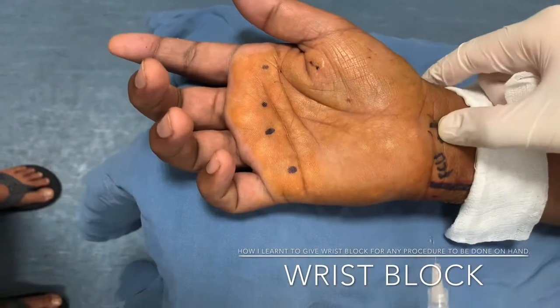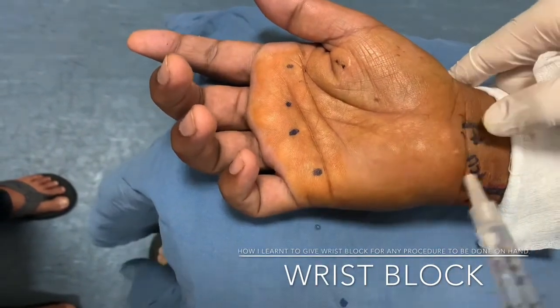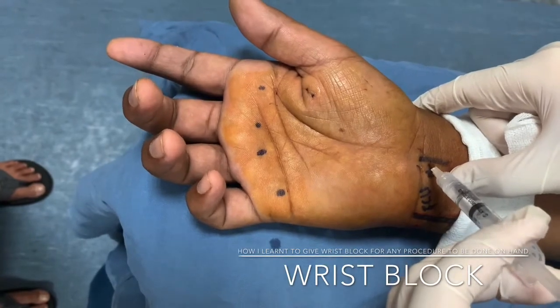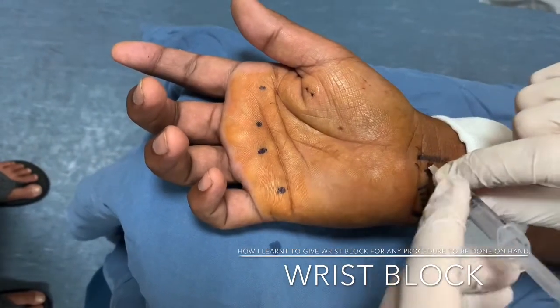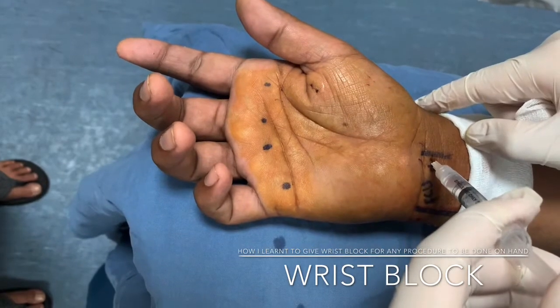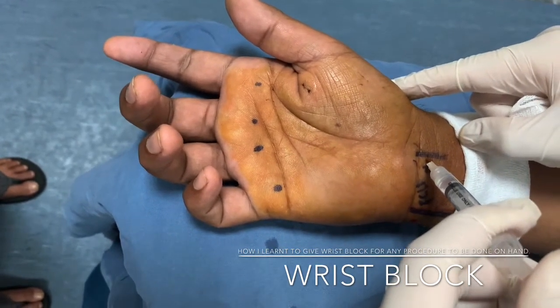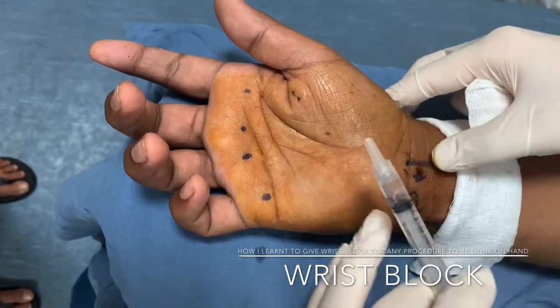Then feel the palmaris longus just near the wrist crease. Remember, in about 15 to 20 percent of patients, palmaris longus is absent. In that case, you have to draw an imaginary line from the third web space, which is between the middle and ring finger, and inject xylocaine near the wrist crease to block the median nerve.